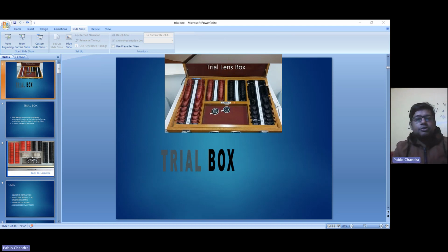Cylindrical lens compartments should be capable of smooth and accurate rotation. As I told you, for cylindrical lenses we need smooth and accurate rotation, because accurate and smooth rotation will help us to get the proper axis.